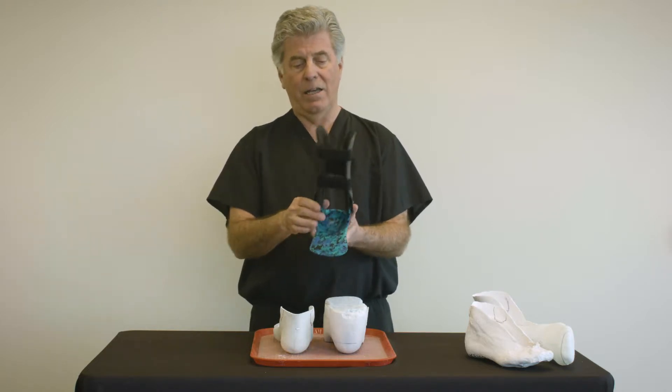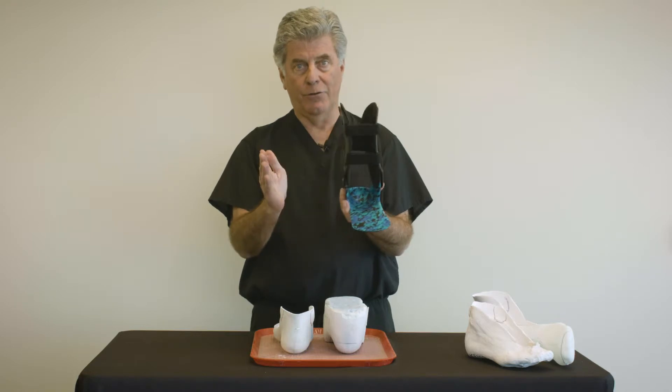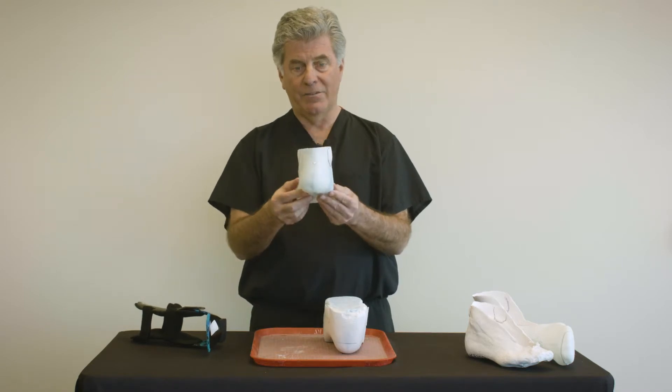When we get a brace that doesn't fit the malleoli properly — either too narrow or too wide — the problem usually originated in the casting process.